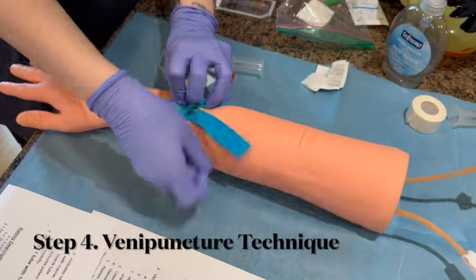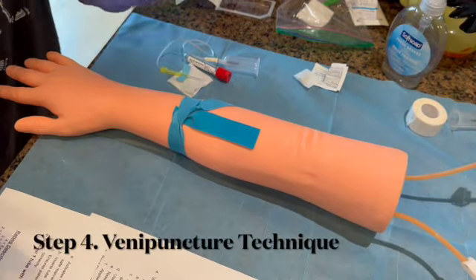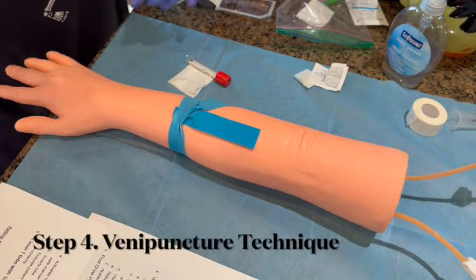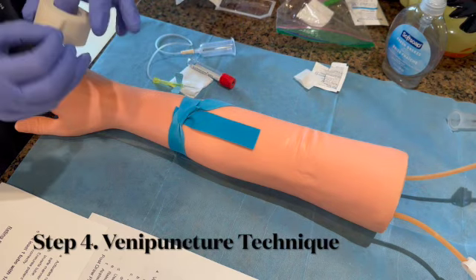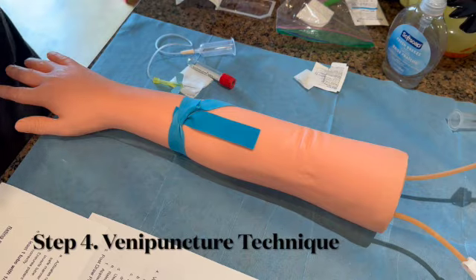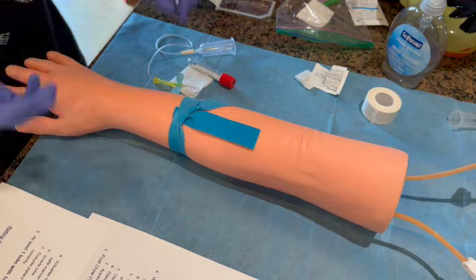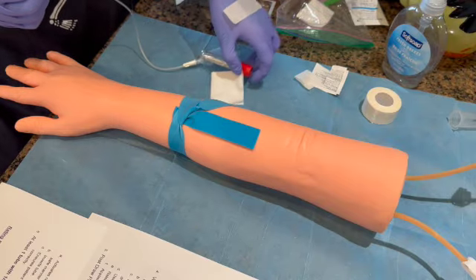So we're gonna reapply this tourniquet onto Robert. And then from here, we are going to get our needle prepped and make sure that we are inserting it at the correct angle and speed for the chosen site. One thing I almost forgot was my tape. And this is a perfect example of, had I forgotten that prior to this process, I would have likely gotten maybe a point deducted. So maybe instead of a 4, I would have gotten a 3, as satisfactory, however, not excellent, because I did forget something and moved on to step 4.